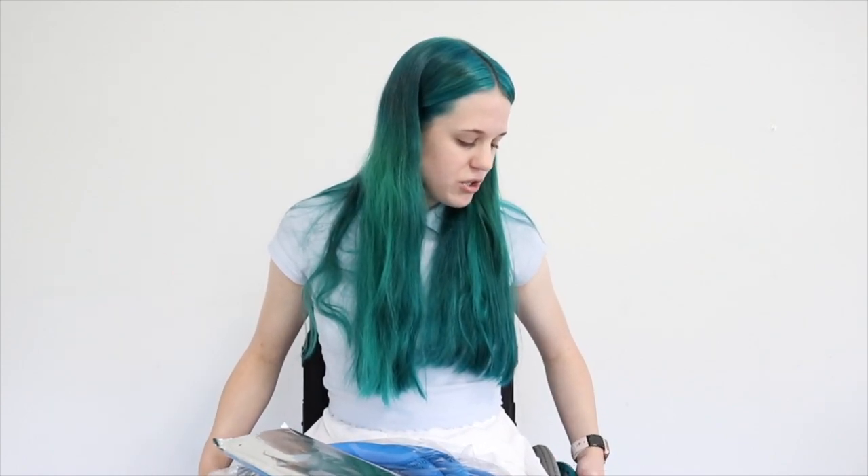Hey guys, this is Hailey and in today's video I'm going to be reviewing some new push rim covers for my wheelchair. A couple years back I did review a brand called Fit Grips — they're on my chair currently, but I believe the business went out of business and they're no longer for sale. Mine are also really dirty and scuffed up because I've traveled a lot and airlines tend to scuff them up. So if you don't want your push rim covers getting ruined, take them off before you fly.